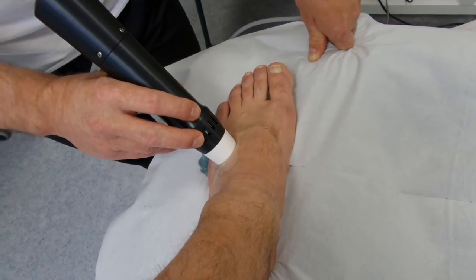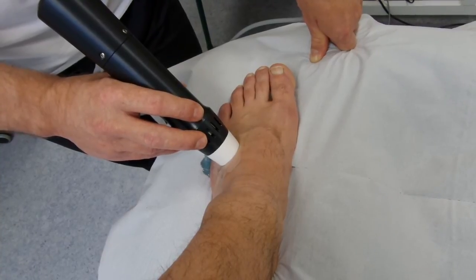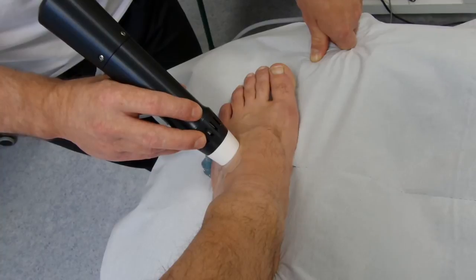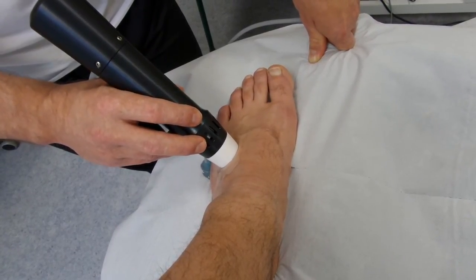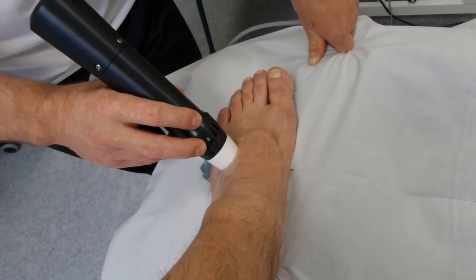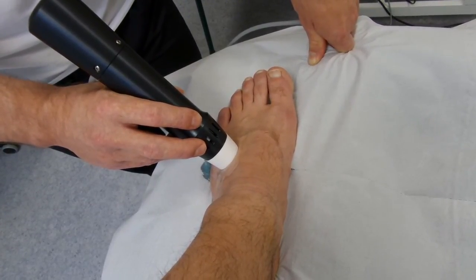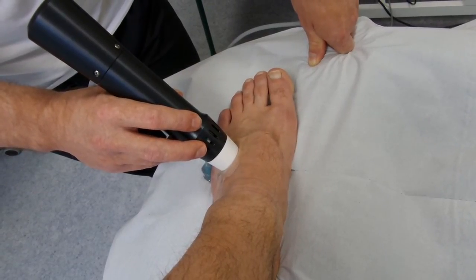As you can see, we keep coming back to the same spot — this is where the bursa is — while also doing the massage around it. With 2000 shocks we have plenty of time to address the trigger point and the area of most pain. The manufacturer would recommend about 600 shocks onto this area, but we might do a few more onto this one spot, angling a little bit as we go along.